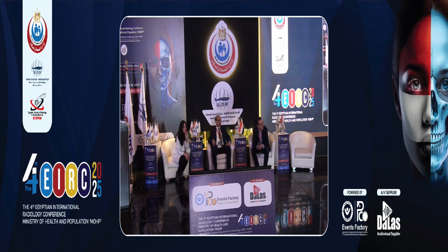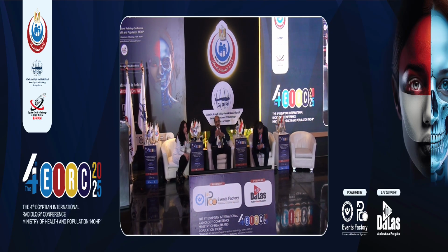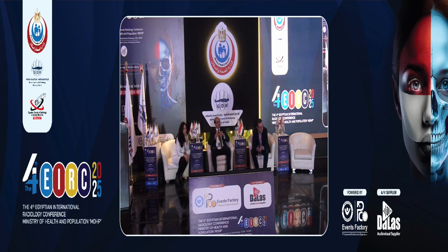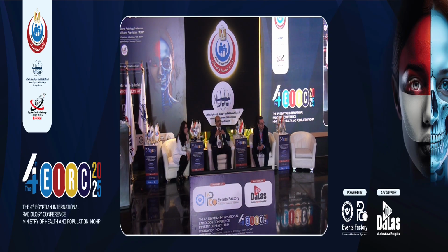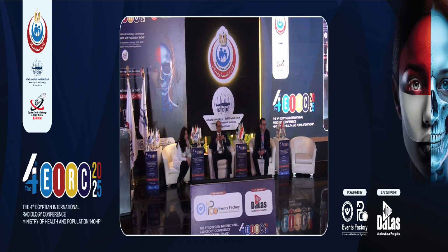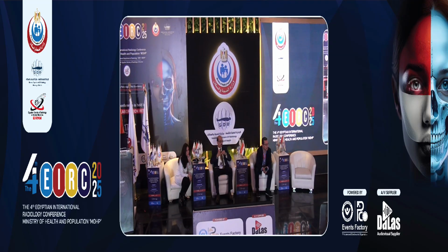So, unless you are very close to where you think it is going to bleed, yes, you can provoke, I think, but if you are still in the SMA and you're trying to find out which artery is bleeding and where it is supposed to be, I don't really recommend that, because some of the lower GI arteries are really very difficult to catheterize. Upper GI is very forgiving. I would just empirically embolize some of the arteries.